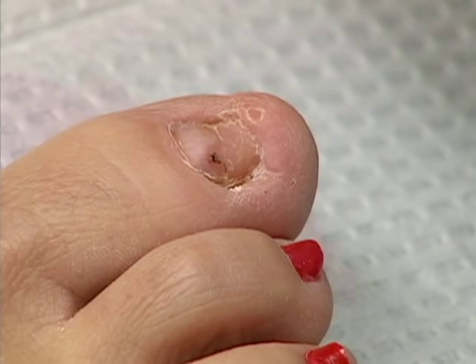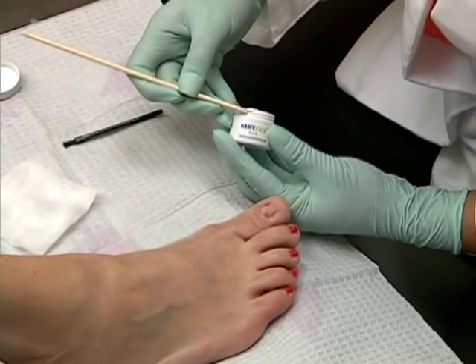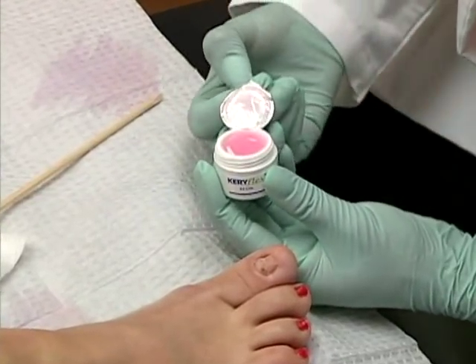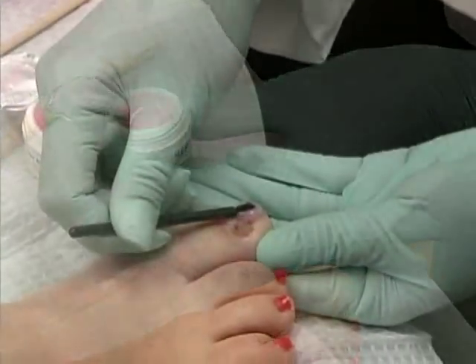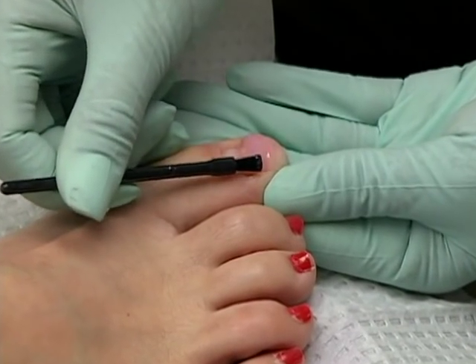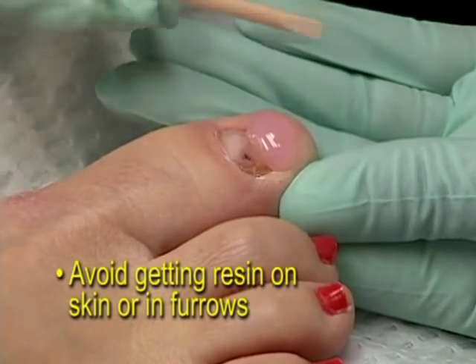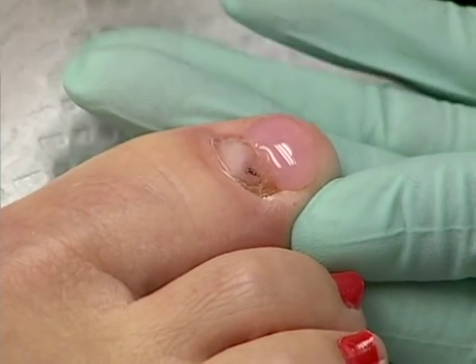After the bond has dried on the nail surface, you are now ready to apply the resin to the nail. The Keriflex resin consists of specially formulated compounds that when exposed to UV light form durable but flexible chains of molecules. Using the black brush in the kit, dip the brush into the resin and beginning at the distal portion of the nail, begin to build the free edge of the toenail. As you apply the resin to the nail bed, avoid getting any resin on the skin or in the furrows where nail and skin meet.